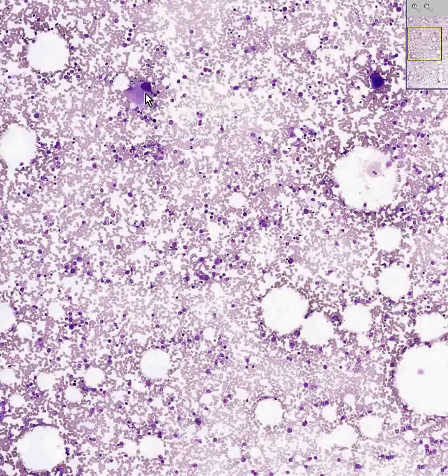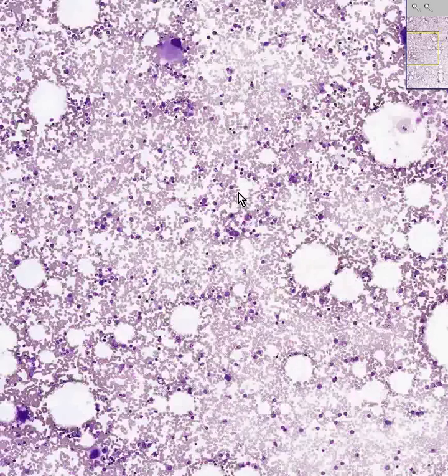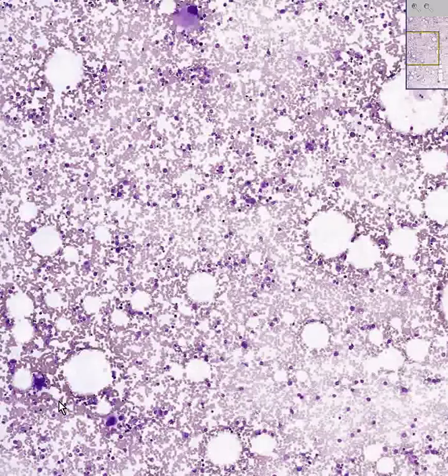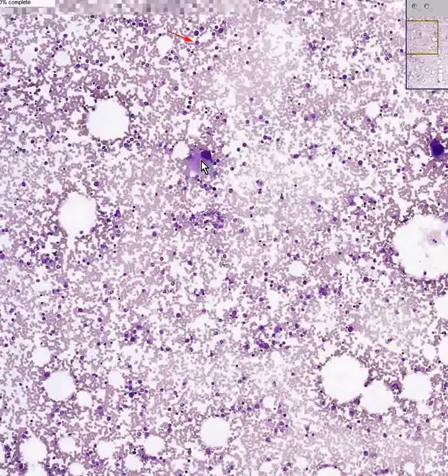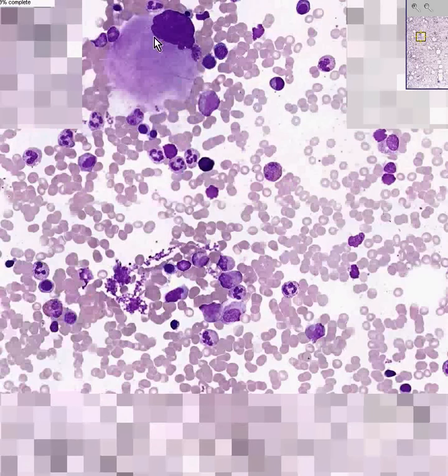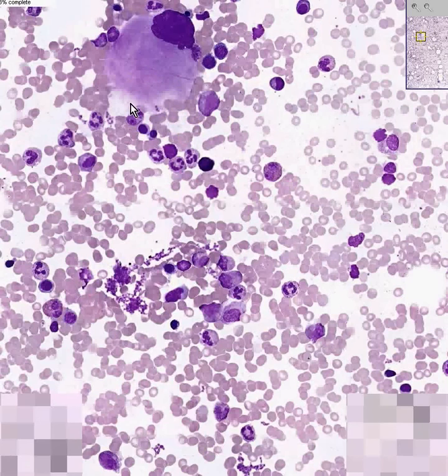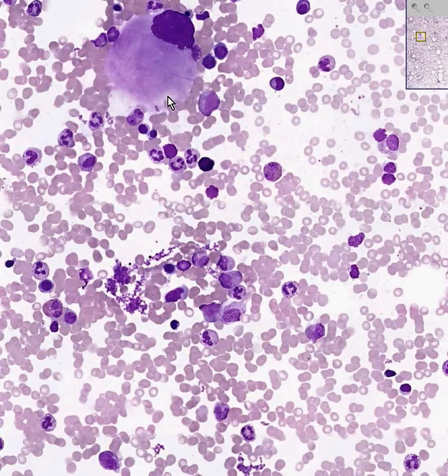Here is a nice megakaryocyte here, and here's one here, and here's a couple down here, just to give you a nice quick view of a megakaryocyte. They have a tremendous amount of fuzzy cytoplasm, and this is where the platelets come from.